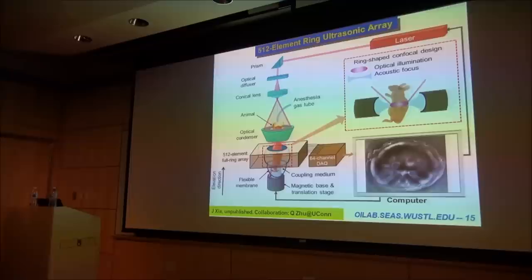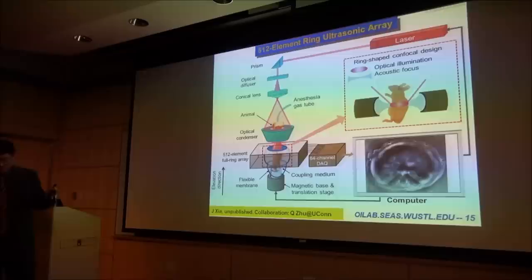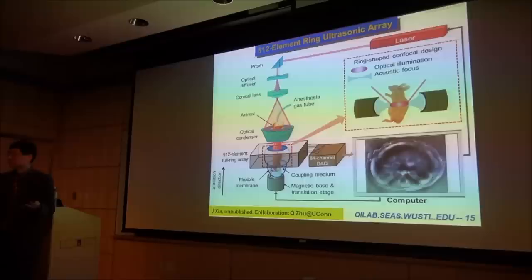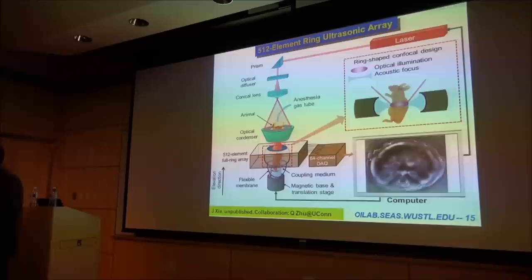Unlike X-ray CT, where X-rays travel straight through, so you work in transmission geometry, the photoacoustic wave propagates in all directions. Right, so that means your design geometry can be very versatile. Depending on which part of the body you want to image, you can refine your geometry. For a trunk, we use side illumination, bilateral detection. For brain, we use top illumination, but the same lateral detection. So we can use the same detector array for many different anatomical sites.